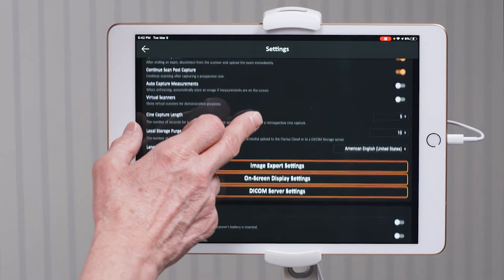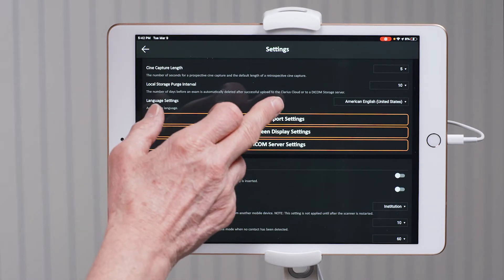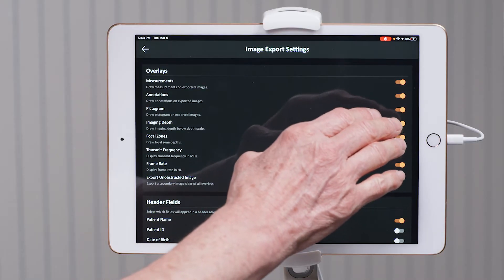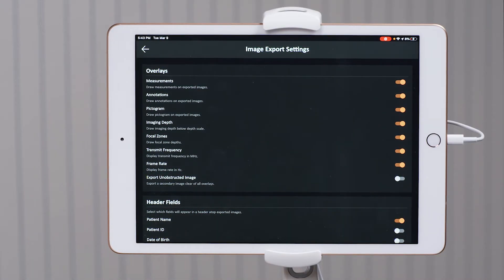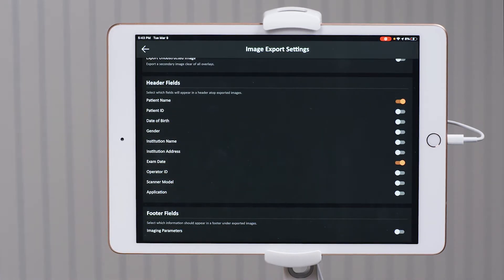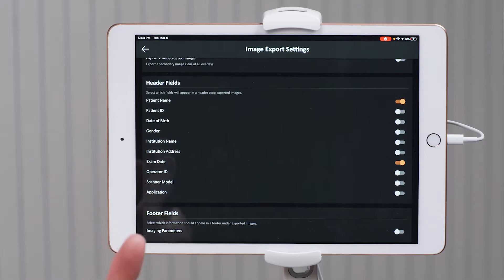The next item I like to cover are the image export settings. You press image export settings and then you will see the overlays that will be included when you export your images. Already turned on in the app are the first seven, and I recommend that those stay on. As I scroll down, the patient name is turned off in your app, as are all of these options. This is up to you and your institution. For me, I like to export the patient name as well as the date of the exam.